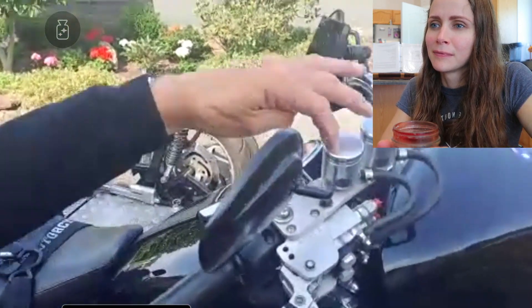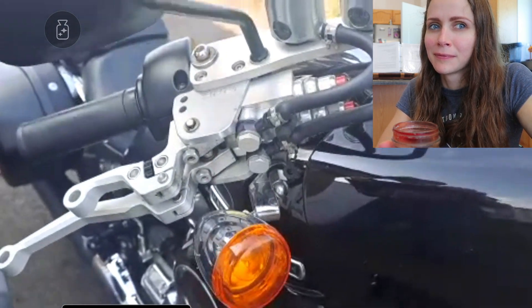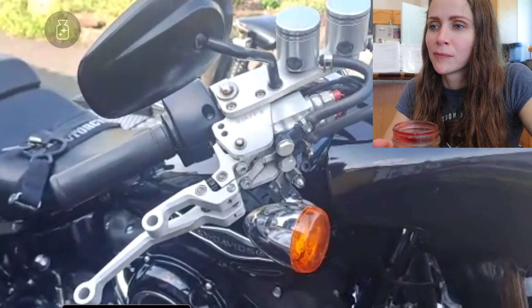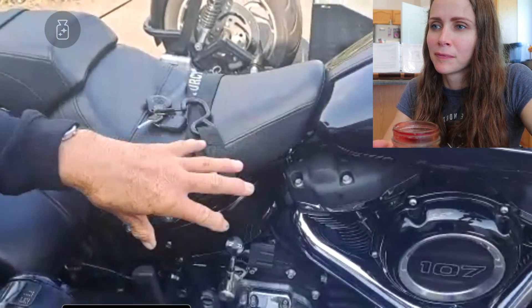These are the two master cylinders for all the different brakes — it's a really good setup. You buy a kit that comes all together, and you buy it from a place in England. We can give you the address later.